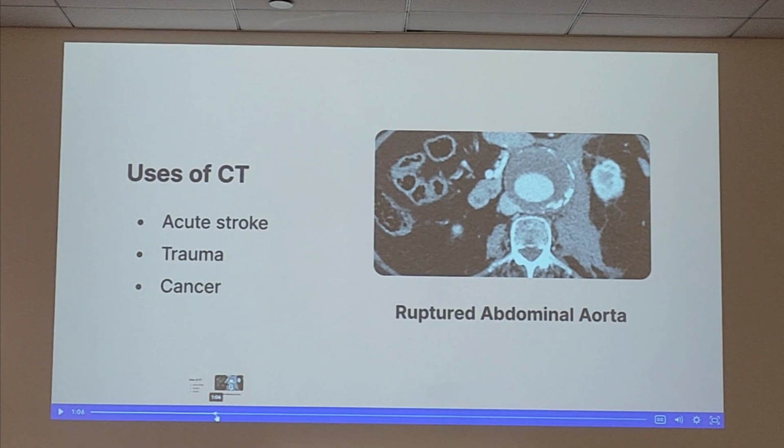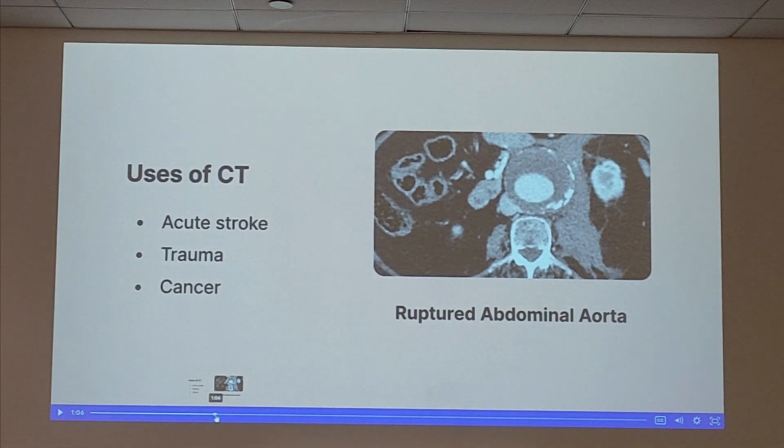This is actually learning from when I was an X-ray tech. No, it shouldn't be the extremities. Yeah, it's usually just the head. Like a whole axial skeleton, just to see if there are any fractures or breaks or anything like that. And that's probably a new protocol, because that was not a protocol when I was scanning. But it's been a minute since I was scanning.